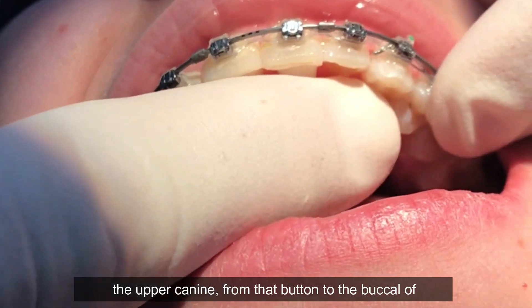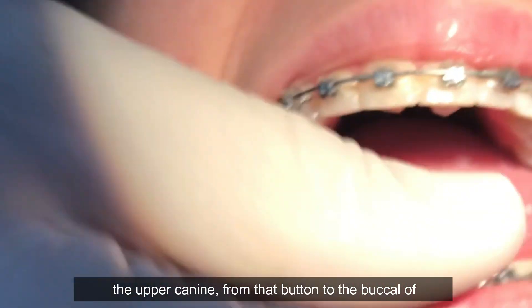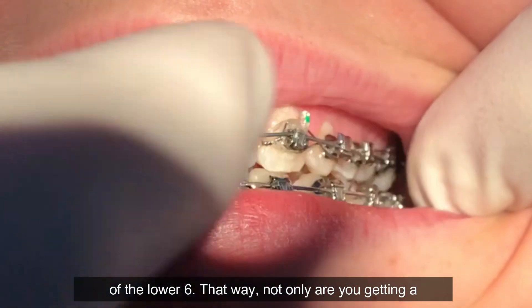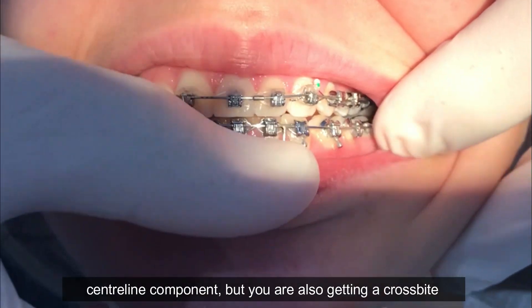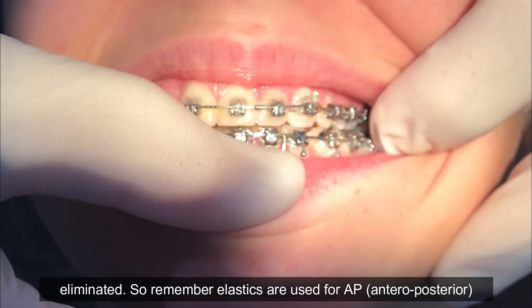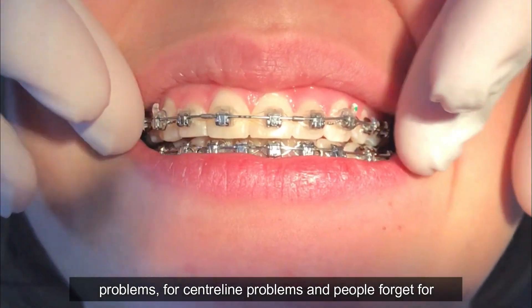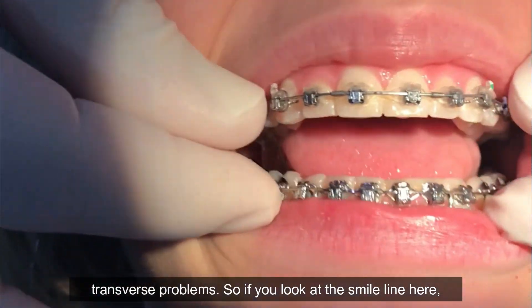When you're using elastics, this is a 3b short, where we put a button inside the upper canine. From that button, biting together to the buccal of the lower six — that way, not only are you getting a center line component, but you're also getting the cross bite eliminated. Remember, elastics are used for AP problems, center line problems, and people forget, transverse problems.